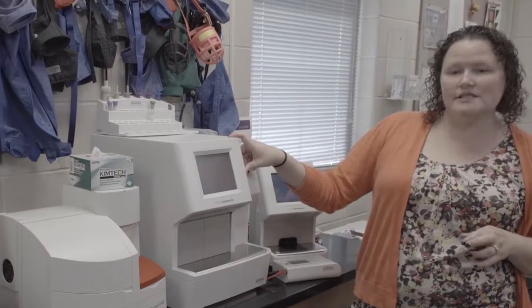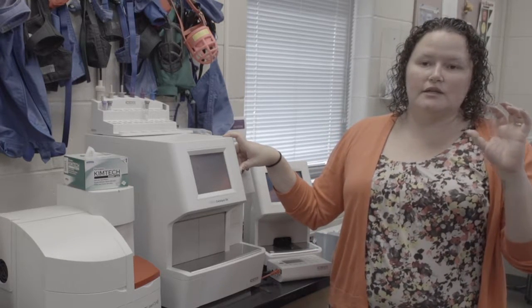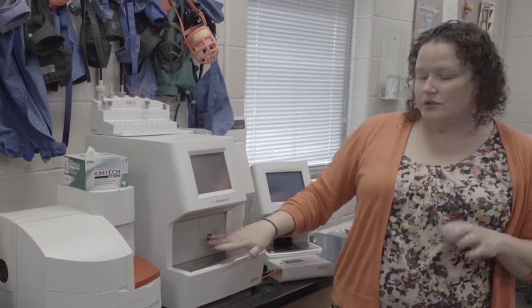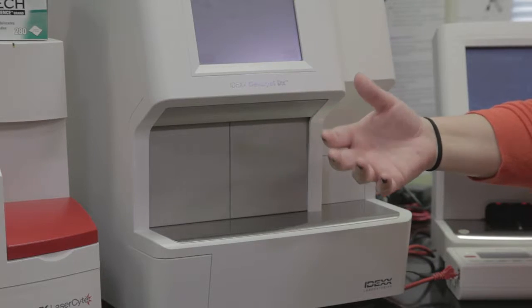Best practice when it comes to that is your electrolytes are the most sensitive. And if you're running a sample, the electrolytes should be on the bottom. Any chemistry is on top of that. And then any other individual slides on top of that. Okay? So these are your sample drawers. You have the ability to run multiple samples at a time. It will default to this left side if you're just running one sample at a time after another. But if this side's busy and you go to start another one, it will actually open up this side.